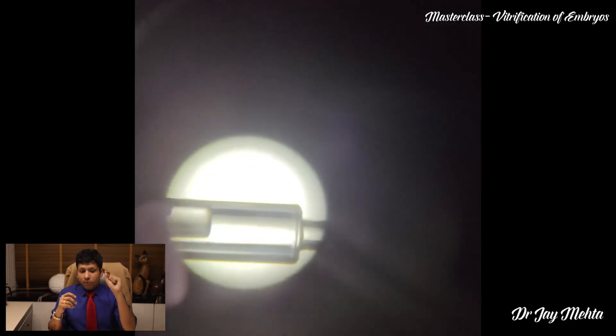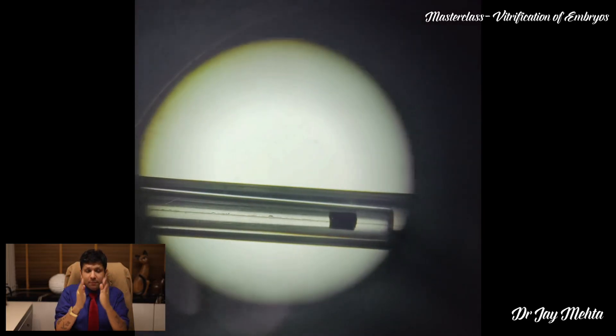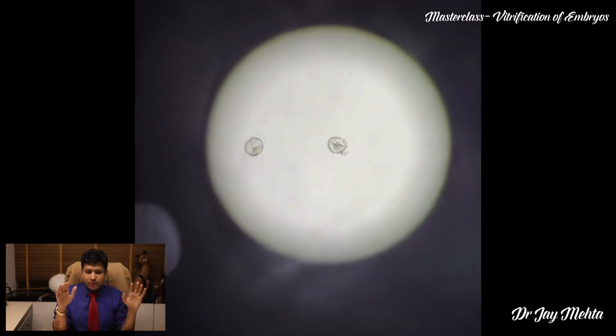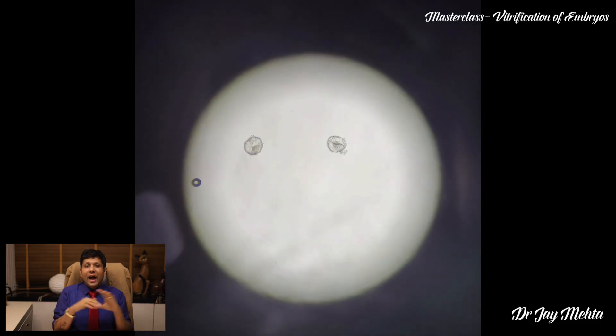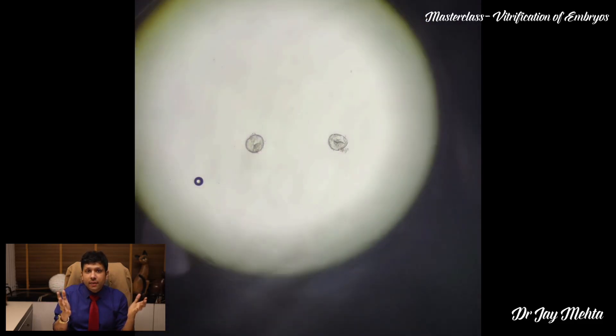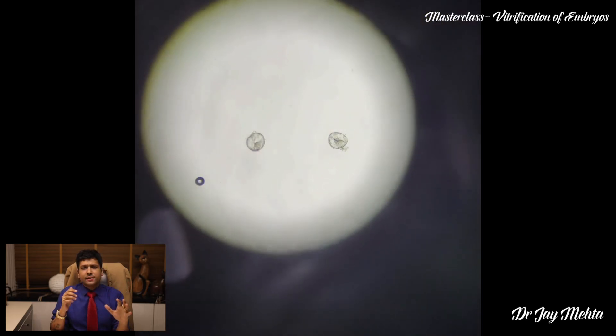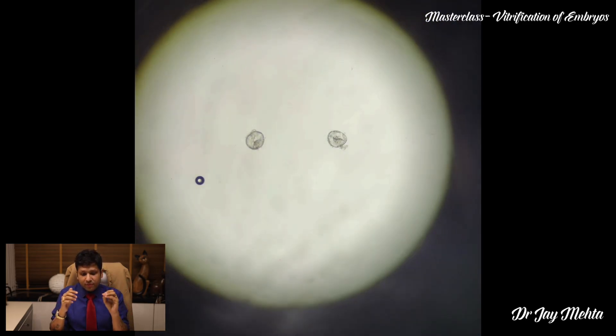Here is the actual skill. Once that one minute of vitrification is finished, you need to pick the embryo up and load it, and the surrounding cryoprotectant fluid should ideally be less than one microliter. Once you have achieved that, you will allow good permeation of the cryoprotectants which can then be vitrified. When you vitrify these embryos, ice crystal formation inside the embryos is going to be avoided and these embryos are going to have excellent survival rates.